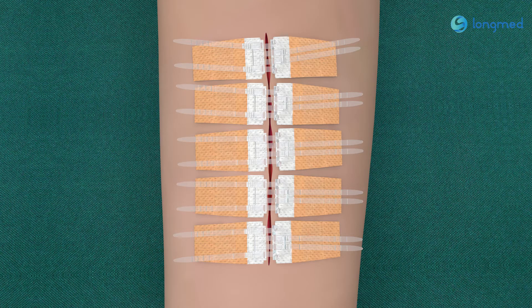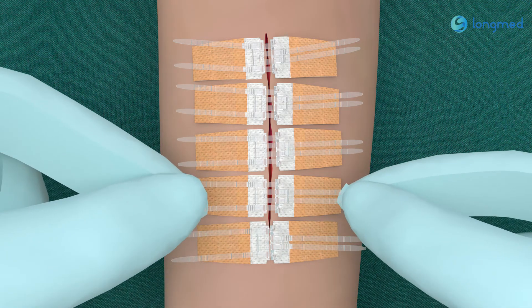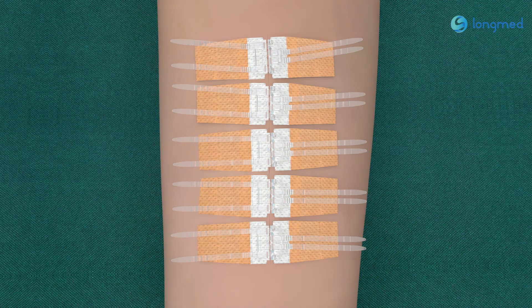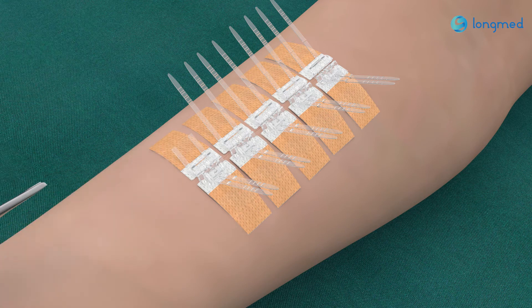Six: from one side of the wound, hold the pull strap of the pull buckle with both hands in turn and pull the pull buckle to the appropriate position with two horizontal forces in opposite directions. Seven: cut the extra pull tape carefully.